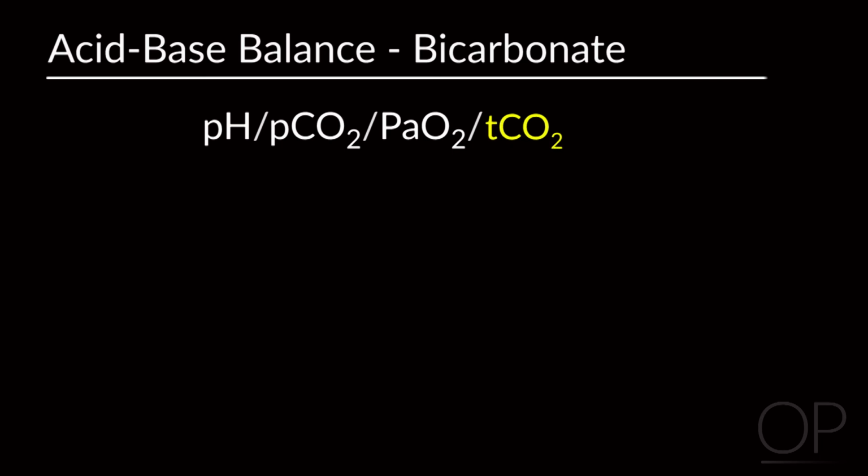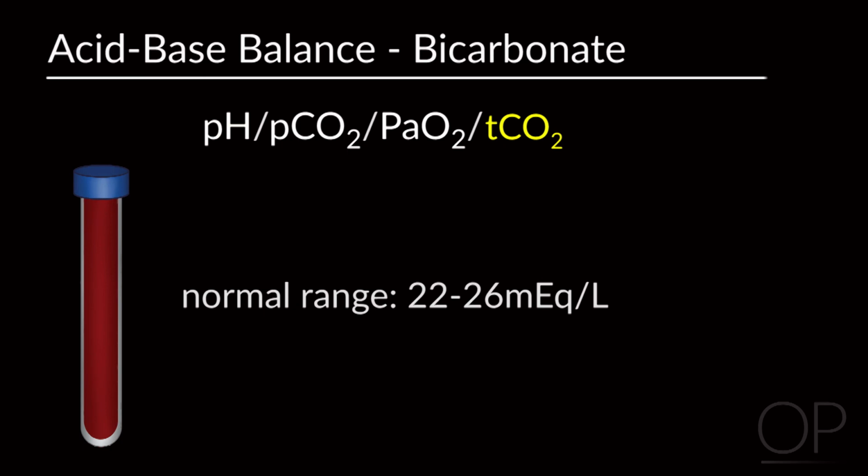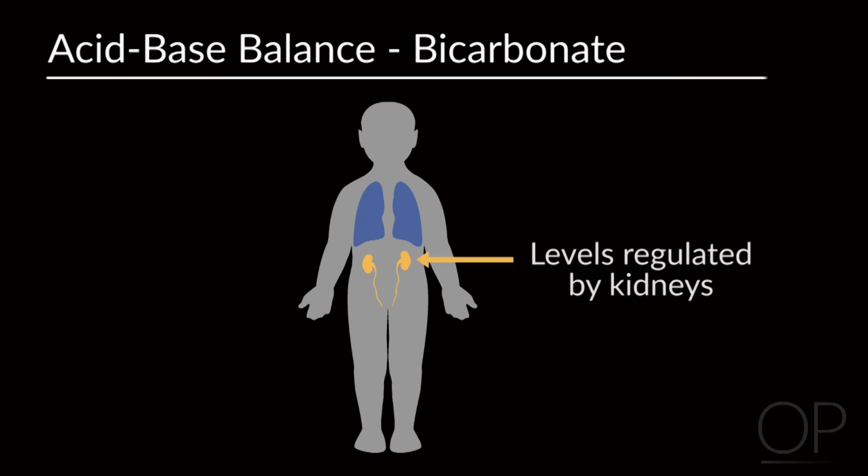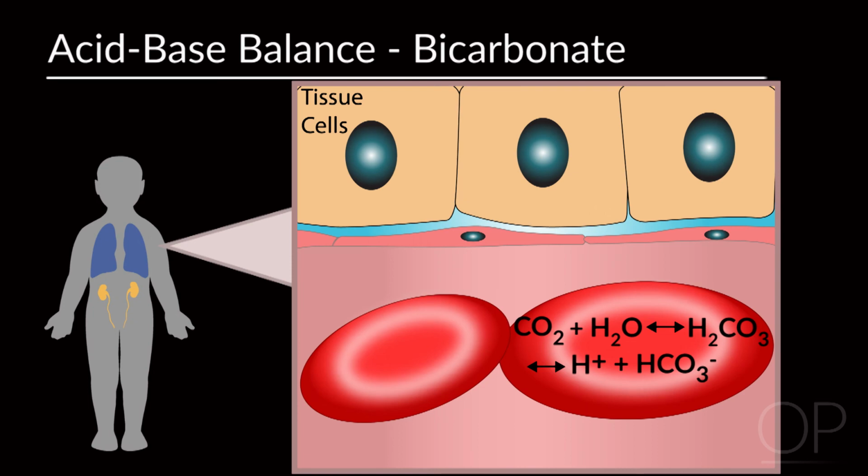The normal level of bicarbonate in our venous or arterial blood is 22 to 26. Bicarbonate is a physiological buffer that is maintained mainly by our kidneys to attain a normal pH. Bicarbonate values outside the normal range are usually influenced by metabolic conditions or in response to changes in acid-base status. It is easy to be confused by TCO2 in reference to bicarbonate. Since CO2 mostly occurs in the form of HCO3, bicarbonate, in the bloodstream, bicarbonate is represented by the total calculated value of CO2 in the blood.